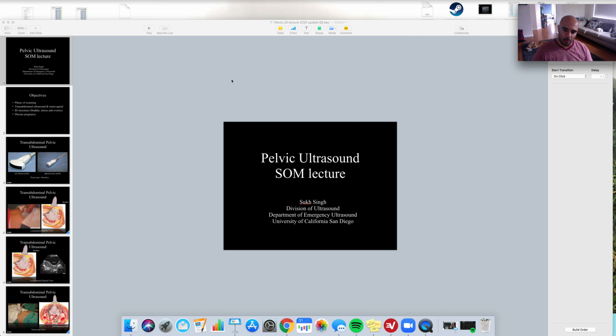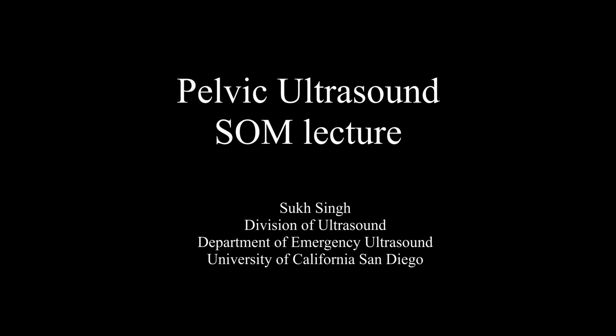Hope you watch this video before we all hang out in person, and then when we get together in person, we can do some of these scans with a hands-on approach. So let's talk about pelvic ultrasound.